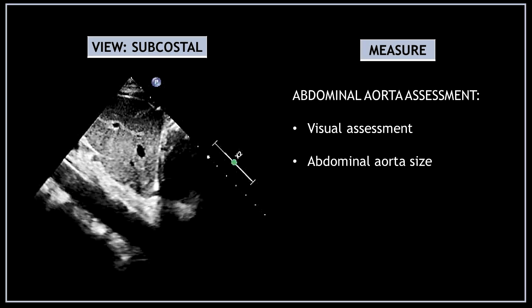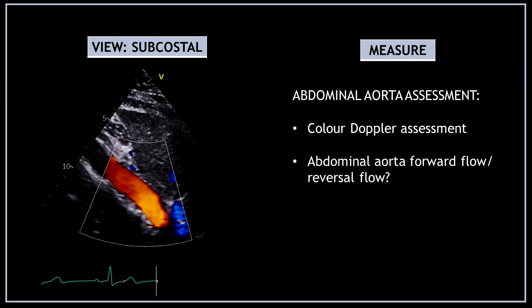Using a different angle you can find the abdominal aorta. First visually assess the abdominal aorta and measure its size. Then use color Doppler to assess the abdominal aorta forward flow and visually check for any reversal flow.